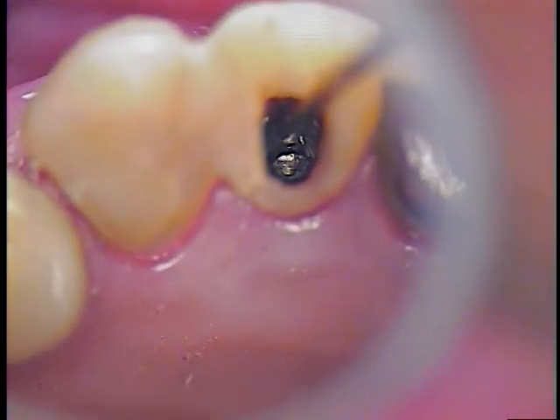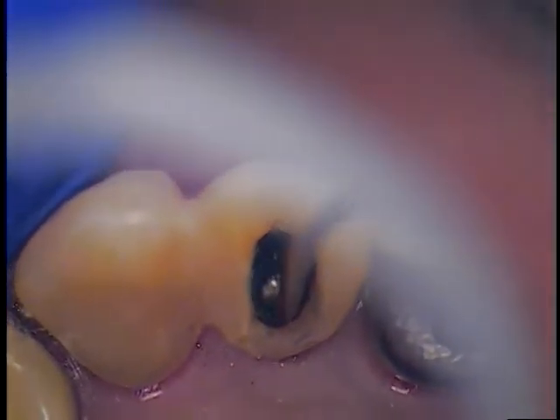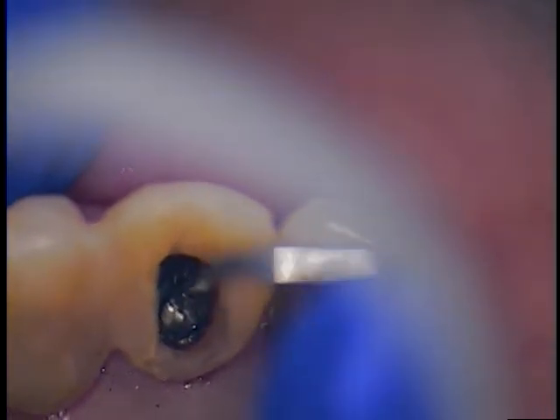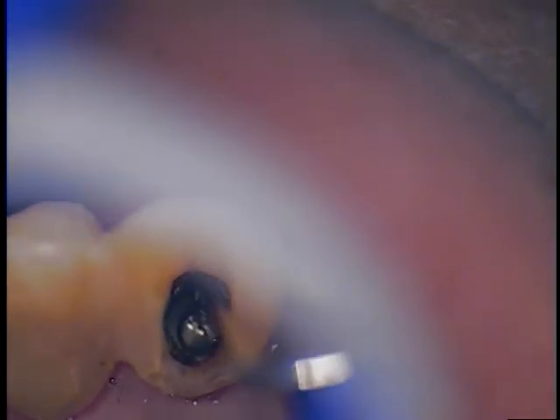Alright. Let's take a jump. Nope. Yeah. Okay, we're working. Almost there. Something in there? You can see how tedious this is. There must be a lip holding this back. And I don't want to grab any more filings, so let me just try to suction this out. Come in quietly here. I need a little more volume on suction. Maybe a larger tip, a pink maybe, if we have any. Trying the kit in our kit. Otherwise, we'll get this one another day.